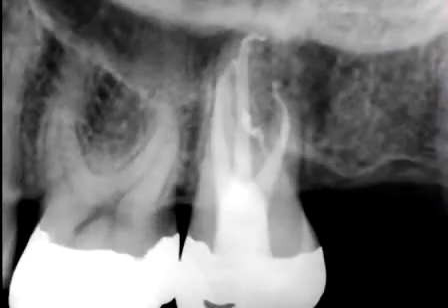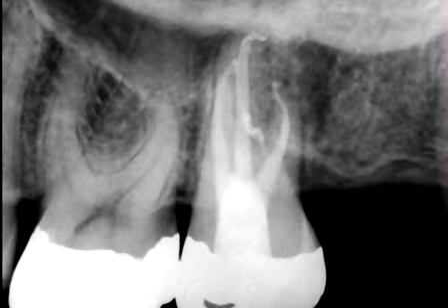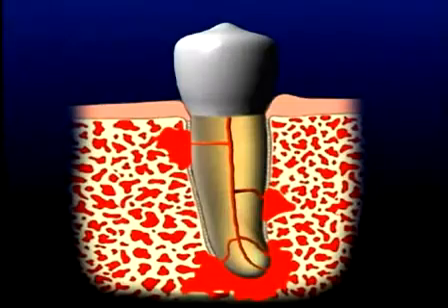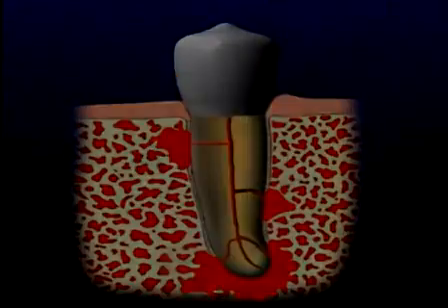Root canal systems commonly contain branches that communicate with the attachment apparatus furcally, laterally, and often terminate apically into multiple portals of exit. Consequently, any opening from the root canal system to the periodontal ligament space should be thought of as a portal of exit through which potential endodontic breakdown products may pass.